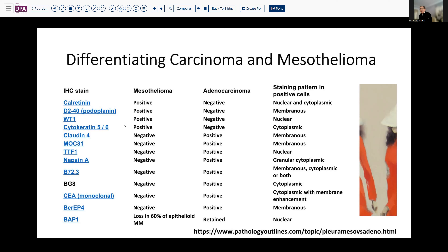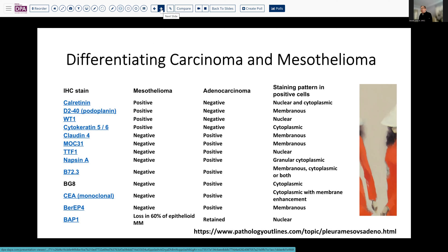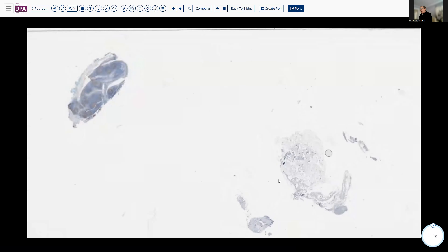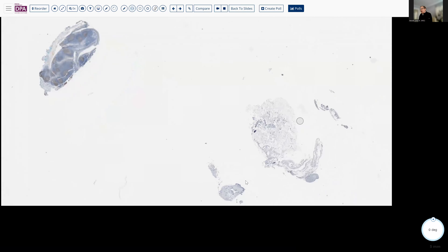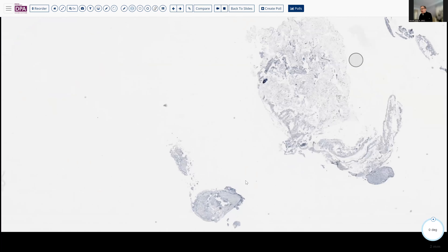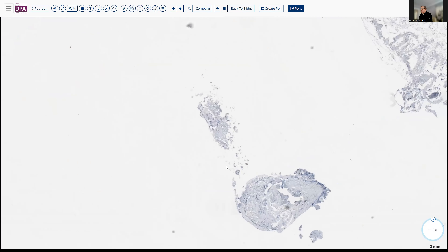So which do we choose? Well, you choose based on what's available to you because timeliness is important. In our laboratory, cytokeratins were ordered, CEA was ordered, and calretinin was ordered based on our most readily available stains. In addition, some people like the value of conventional histochemical stains like mucin carmine as a means of identifying epithelial-derived carcinomas that produce mucin. We'll just go through a couple of the stains here, and as you can see, we quickly exhausted the tissue.